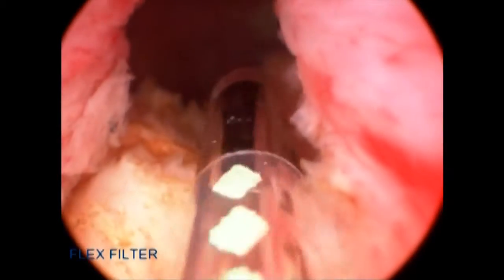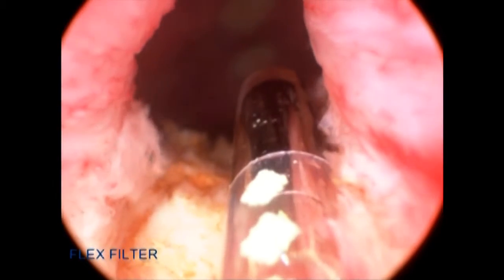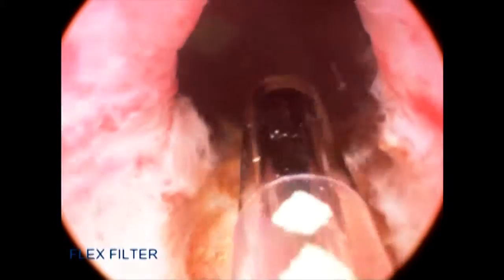Now that I have enucleated the median lobe, I switch to the side-firing fiber and begin my ablation of both the floor and the lateral lobes. I'm using a sweeping, rotating technique from both the right and the left in a near-contact position with the side-firing fiber. I continue to ablate the lateral lobes using the rotating technique. It is very important to keep the fiber in a near-contact position — you don't want it directly on the tissue, but you also don't want it too far away. Keeping it as close to the tissue as possible maximizes energy absorption and efficient ablation.